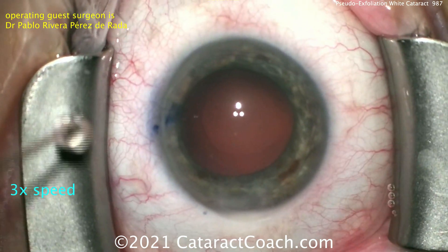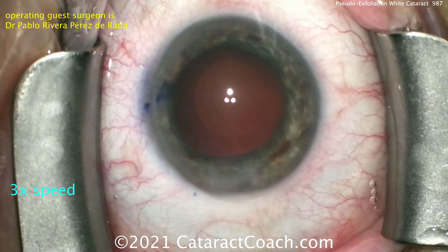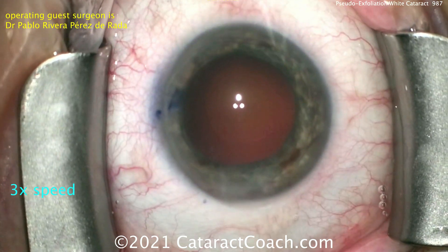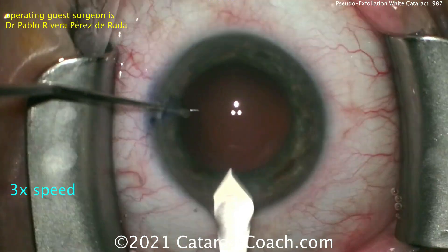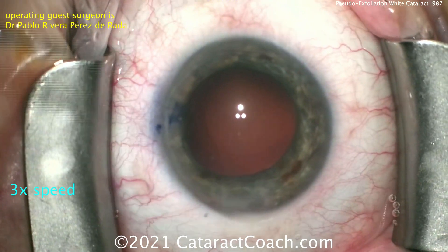So Dr. Pablo is doing a beautiful job, and he is right where he should be. Certainly your skills will continue to improve as you operate more and more. And like I always tell you, you can't be a great cataract surgeon until you've done at least 1,000 cases — you've got to see a lot of these complications. There's a slight enlargement of the incision here, using the keratome and fixating the eye with the second hand.